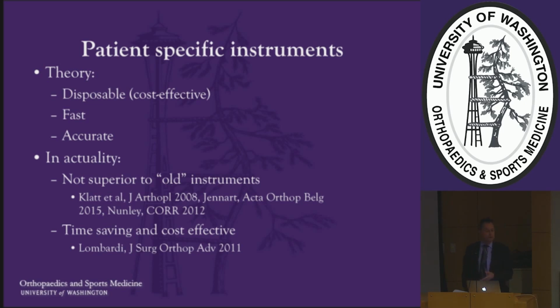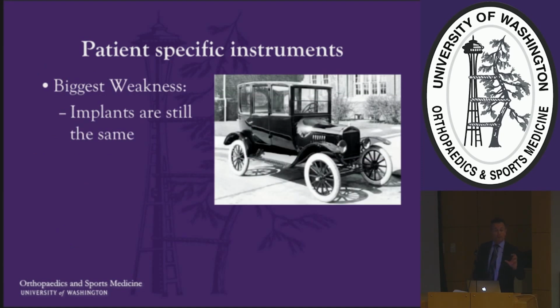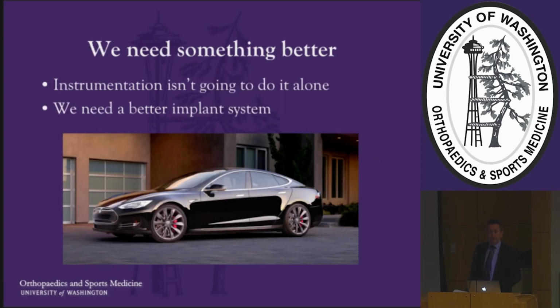And what you find is that they are, in fact, no better at putting the implants in, and they are questionably time-saving and cost-effective. And the biggest problem with patient-specific instrumentation and patient-specific blocks is that the implants are still the same. So you can have any car you want as long as it's black and as long as it's a Model T. Instrumentation is not going to make things better. We need a better implant.